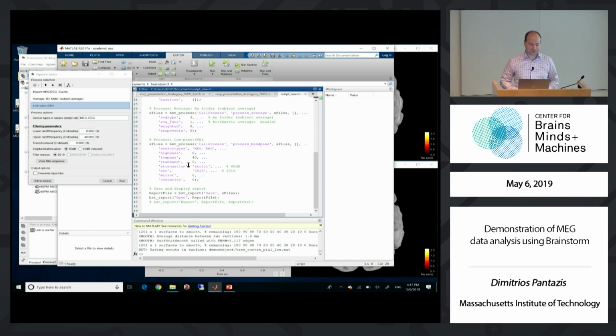And for those of you interested in more complex analysis, I'm happy to discuss in the future and show you how to do different things. And of course, also, I want to point you to tutorials available online, because I only covered a very small aspect of what you can do. And there are dedicated tutorials for very specific types of analysis that one may want to do. And of course, I'm happy to help individuals as well.